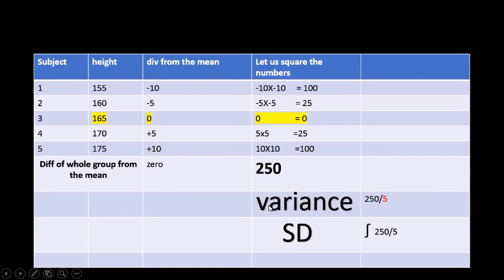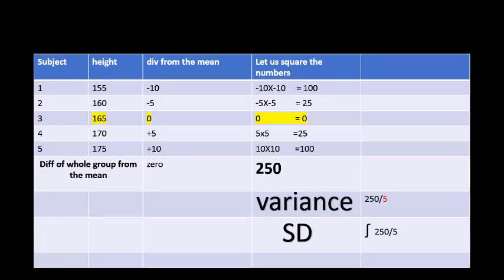In the Octopus, it is termed loss variance. And in the new software of the Octopus, it's written SLV, square root loss variance. And in the Humphrey, it is written pattern standard deviation. So simply, this is not something very hard to understand, but you have to keep in mind these steps.